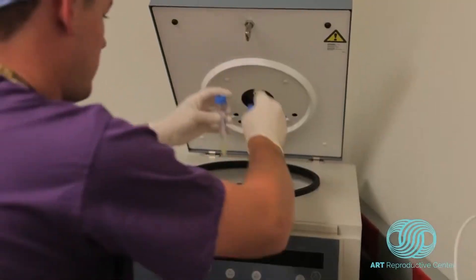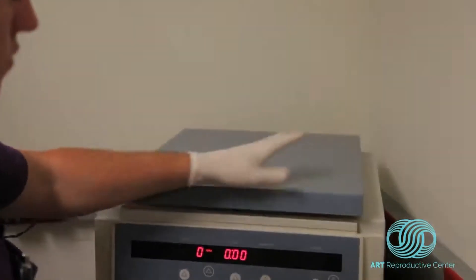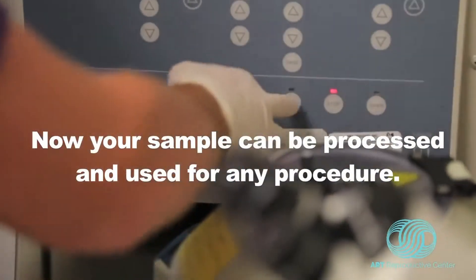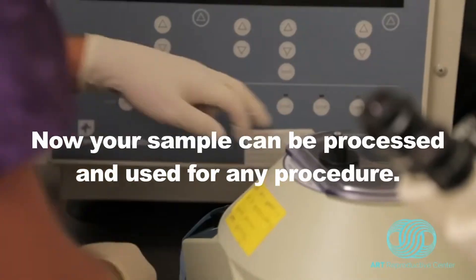Next, the embryologist will process the sample via a centrifuge, and once this is complete, the sample is ready to be used in an IVF cycle.